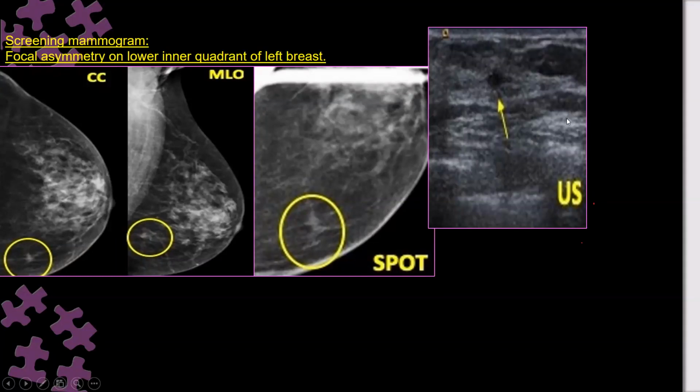How can I solve this problem? Yes, I want to make sure I have taken biopsy from this. I want to make sure this is corresponding to this area. By shape and size, it looks like it. But I want to make sure before completing everything, before just taking biopsy, putting the clips, and that is it. Before that, how can I make sure? One way, just to make sure.